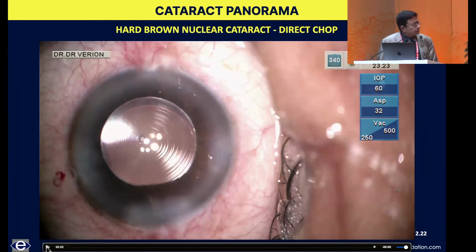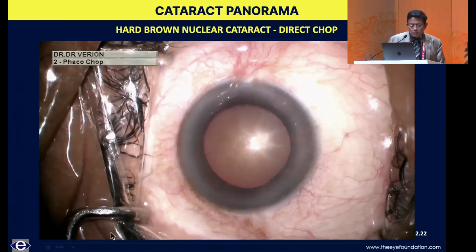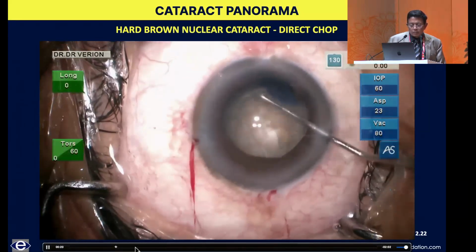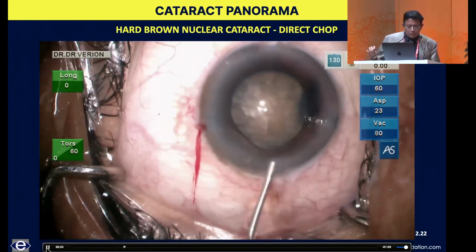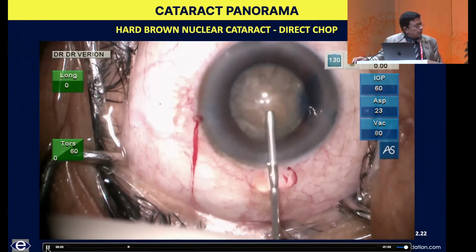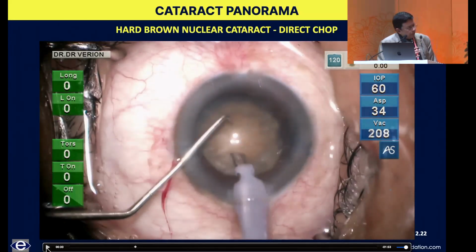And yes, since you asked what I do, in my practice in hard cataracts or white cataracts, wherever I cannot see the posterior capsule, in these very hard ones I don't try to rotate them very vigorously before I start the emulsification. A valid point, because you think there could be a posterior polar element. Yeah, absolutely.